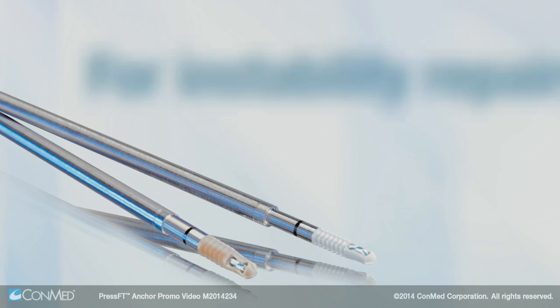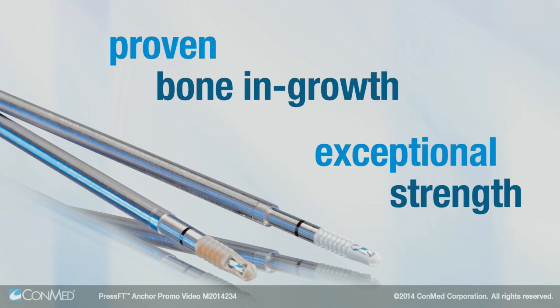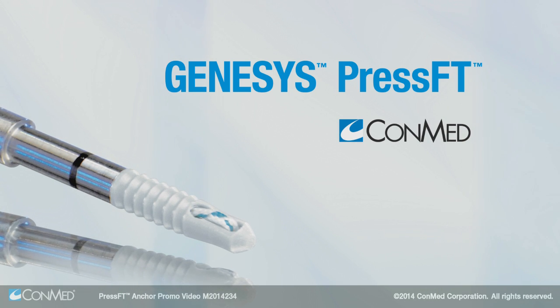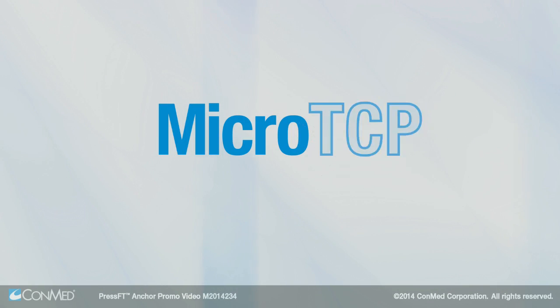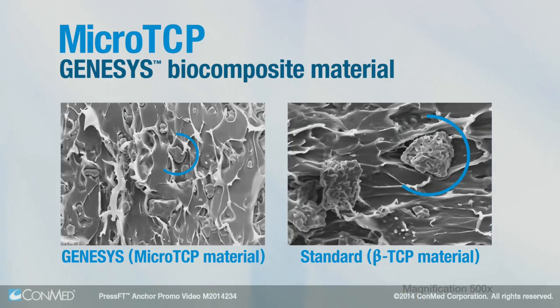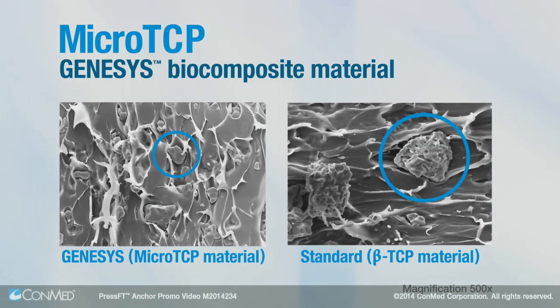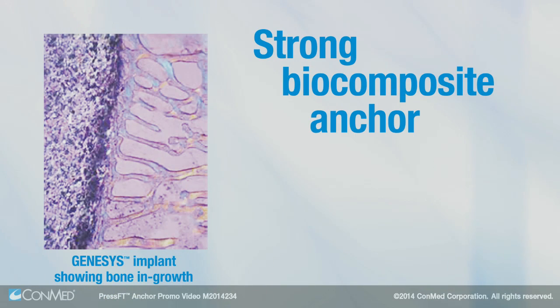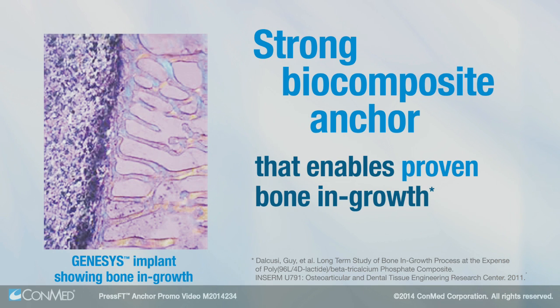For instability repairs, get proven bone growth and exceptional strength with the GENESYS PressFT Anchor from ConMed. These anchors feature Micro-TCP, our proprietary GENESYS biocomposite material that facilitates an even and uniform distribution of microparticles. This results in a strong biocomposite anchor that enables proven bone growth.